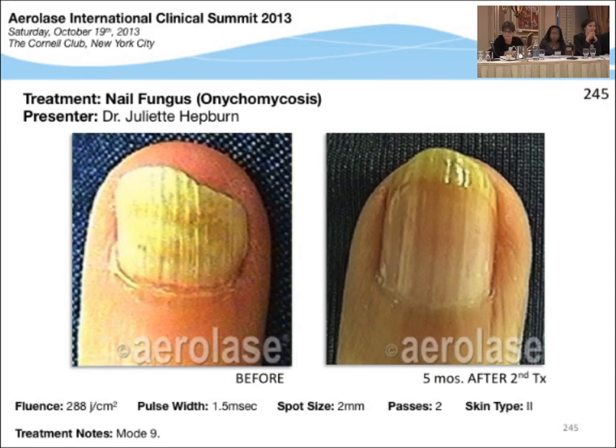It was your first case. How did you have them tolerate the pain? The Zimmer? I did use a Zimmer with her, actually, but I started out without it, and then she was fine even without it, to be honest. I think she was motivated. We did two treatments on her. But by the time I came a month later to do the second treatment, she was, I wish I had the interim.